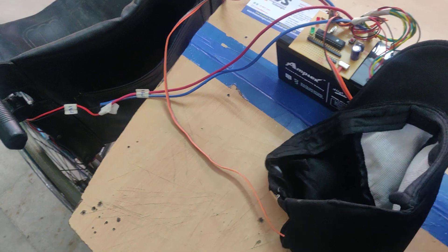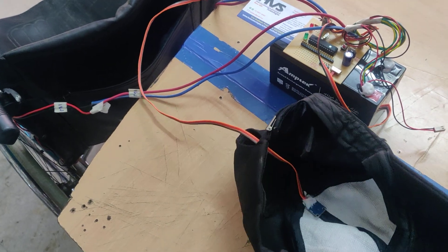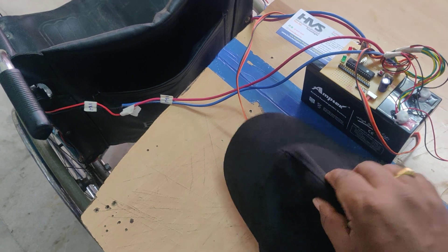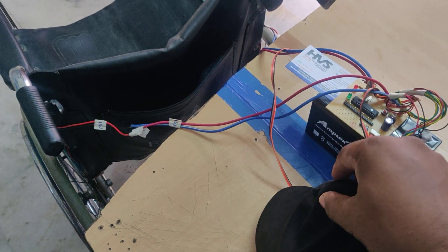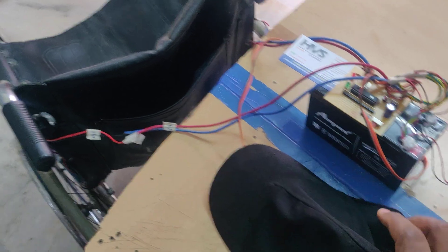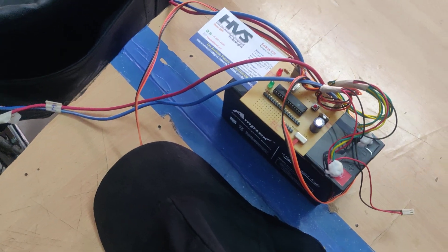That is the ADXL 335 sensor, which is interfaced to the PIC microcontroller at the A0 and A1 pins. Whenever we tilt this MEMS sensor — which we mount on the head — tilting forward makes the wheelchair move forward, and backward, left, and right tilts produce the corresponding movements. These movements are the X and Y parameter inputs connected to the A0 and A1 pins.